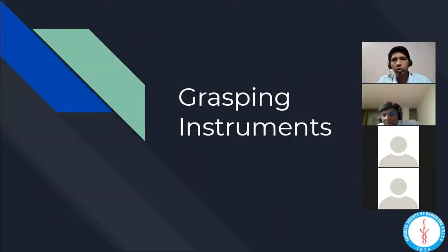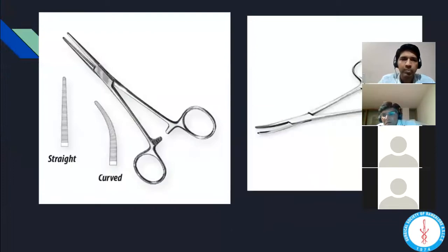So let's move on to a few grasping instruments. For the first two, I'll tell you how you're going to answer in the examination, and from the rest, we'll just pick up the speed and go on. So the first one is a Kelly's artery forceps. They can either be a long artery forceps, a medium artery forceps, or a short artery forceps. They can either be curved or straight.